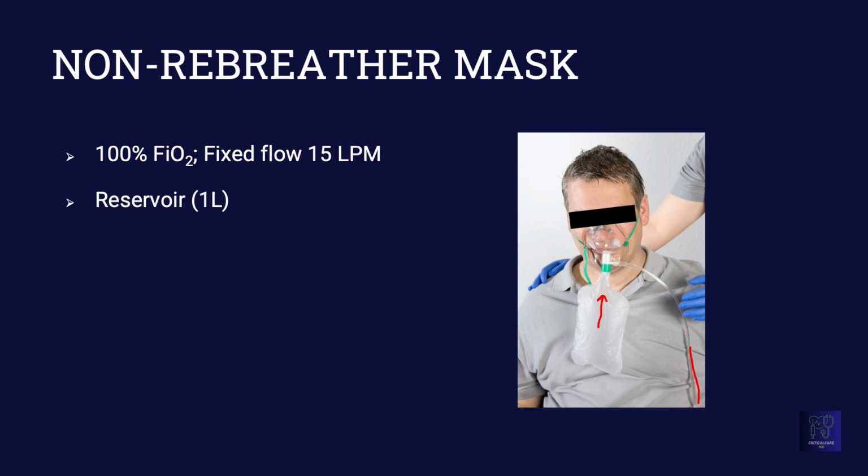When the patient is breathing out, the air is let out through these one-way valves which only allow air to go out but not in. So there is minimal to no mixing of the ambient air. This is a brilliant design that can achieve effective FiO2, meaning FiO2 at the level of alveolus, up to 95%. There can still be some mixing of the ambient air due to improper seal, so there can be a little bit of dilution, but FiO2 reaching up to 95% is a major advantage with this non-rebreather mask, making it a very potent tool for supplemental oxygen.